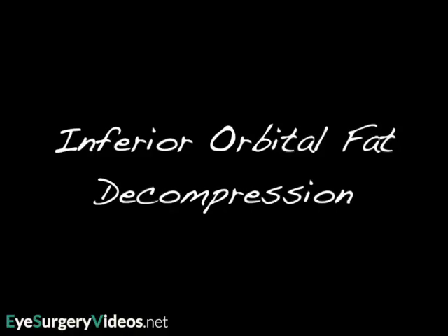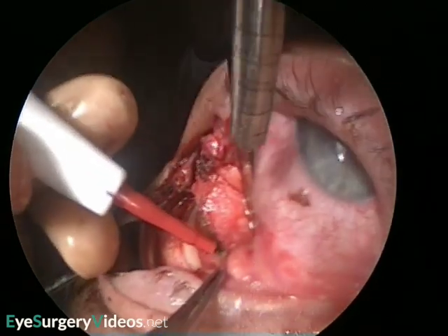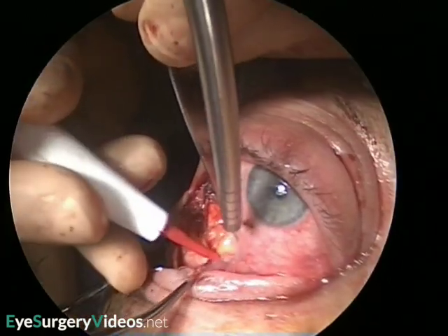The inferior orbital fat is being excised through a swinging lower eyelid incision that has been used for a bony decompression. This orbital approach and lateral wall and orbital floor decompression are shown in other videos on this website.